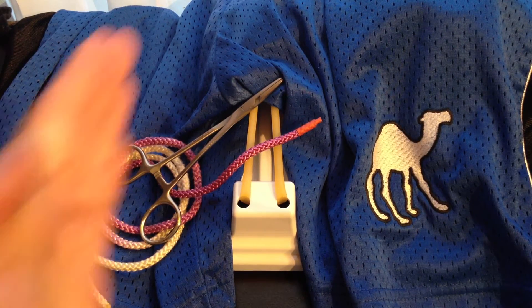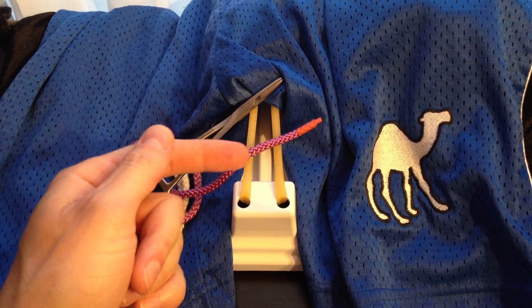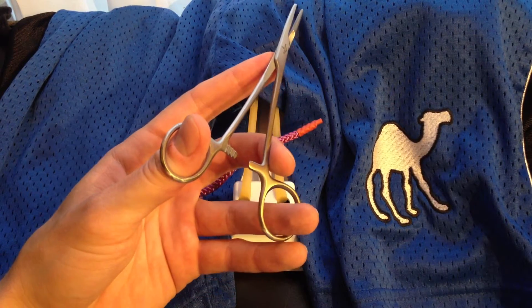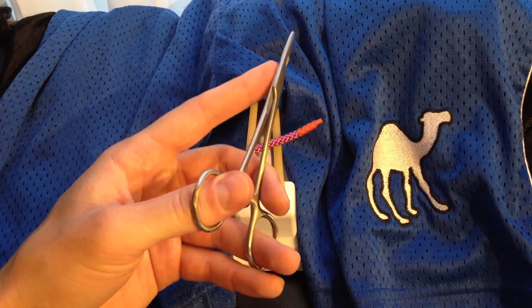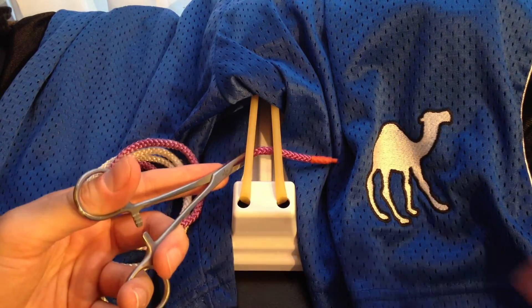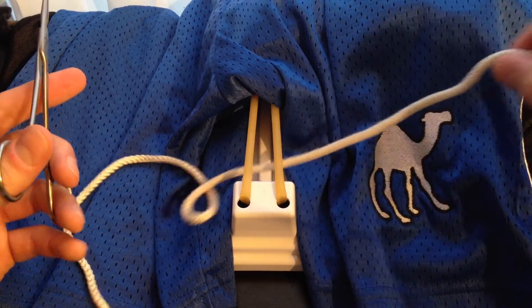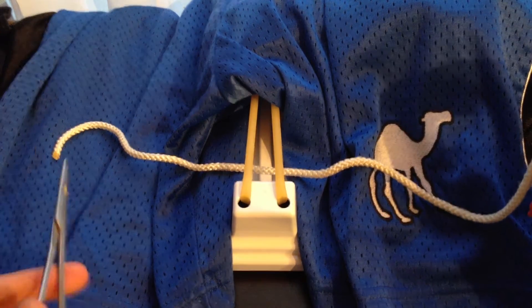So to start, we've got our incision pointing away from us, and we've got the needle attached to our purple thread. You're going to pick up your instrument, and the proper way to hold this is with your thumb and your ring finger. You can use your pointer finger near the top to give you a little bit more control. You're going to grab your needle, and we're going to thread from left to right.